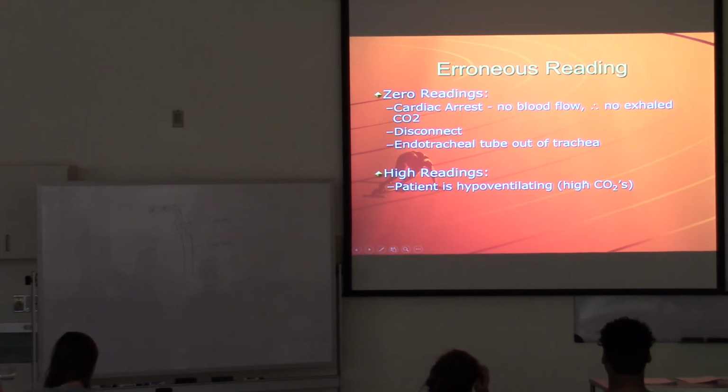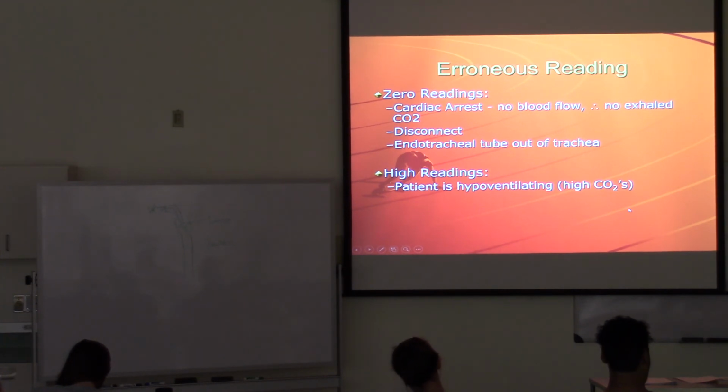It's too funny. And then if the CO2 readings are climbing, you're at 35, now they're 40, and now they're 45, what's wrong with your patient? You need to switch out the end-tidal adapter, it's wet. Or the patient is hypoventilating.